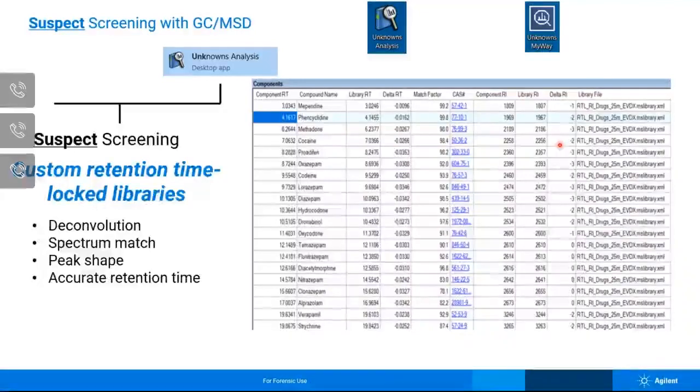Now, what allows me to do this is as I'm doing my data analysis method, I can include these parameters in my data analysis method, which is going to report the difference in retention time and or the differences in retention indices, therefore giving me an additional level of confidence in not just my spectral match, but also my retention or my elution match with that specific compound.